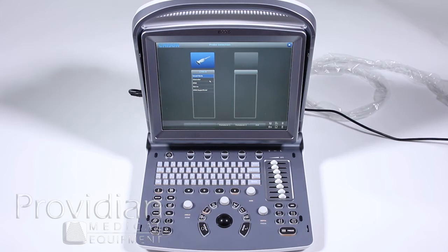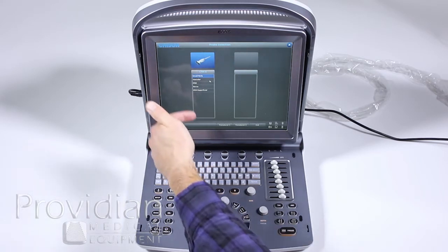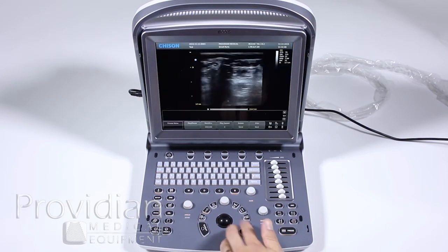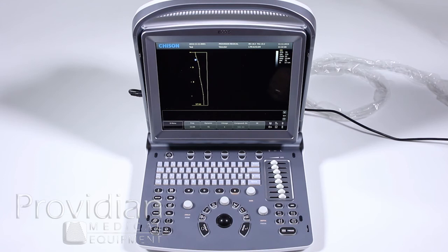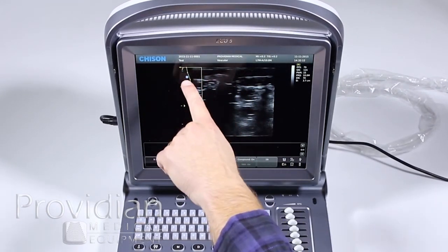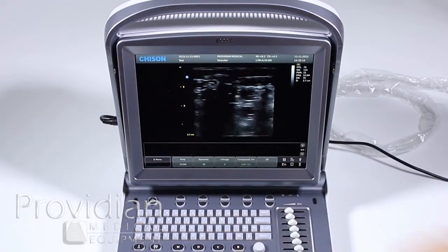If you don't see the study you want — say you have a convex probe and want a vascular exam — there's a part in setup where you can add different presets, and you can also create your own preset in the system setup section. For now, we'll click vascular. Up here you can see the patient ID, patient name, and that we're in a vascular exam.